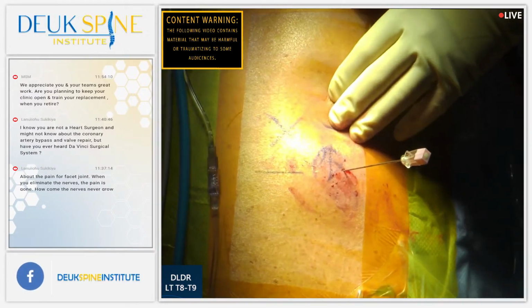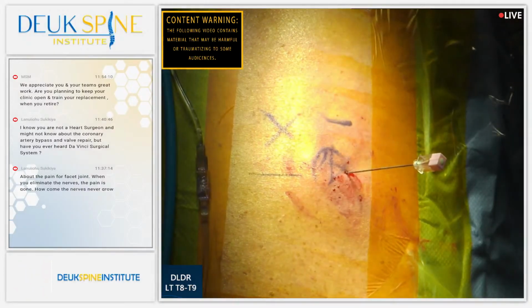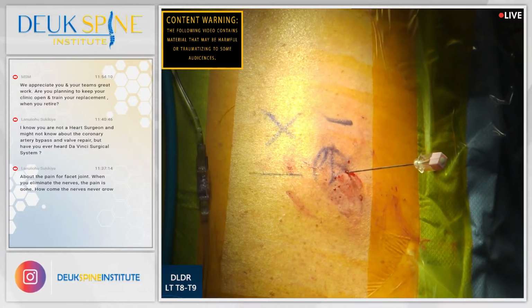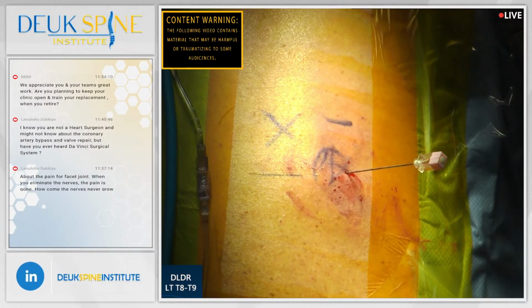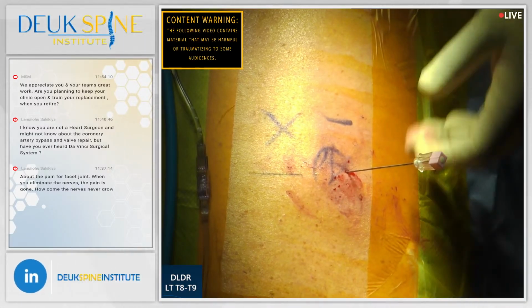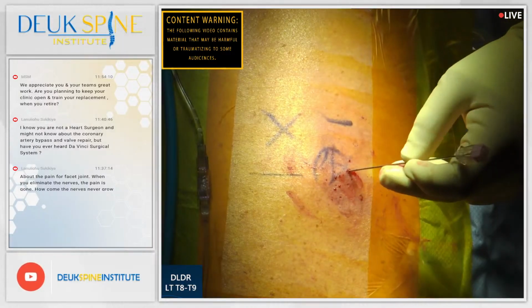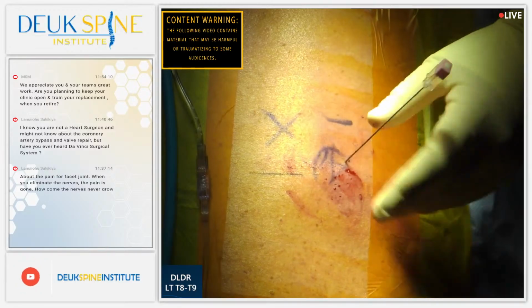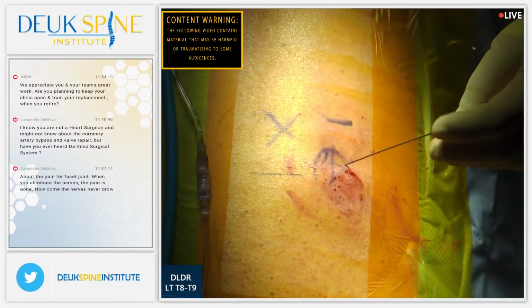We've tried so many different positions. Let's see. I'm not sure how much lower I can go. I don't think I can go any lower. I mean, we tried upper, we tried neutral, we tried lower. I'll just try one more, but I just don't know that this is going to work.